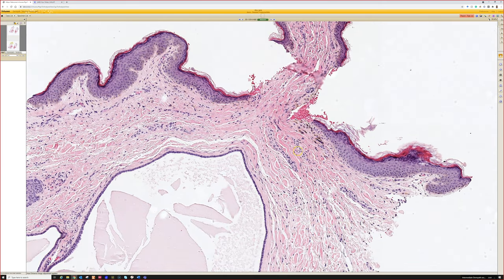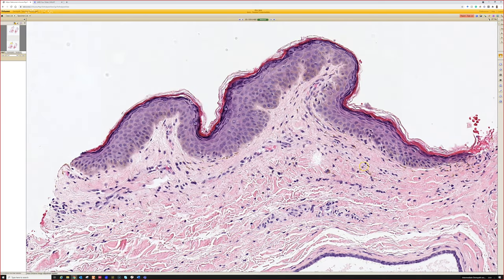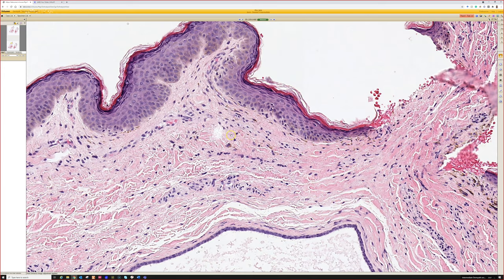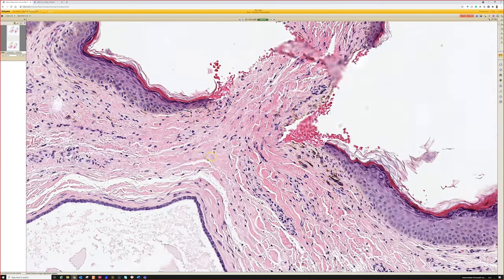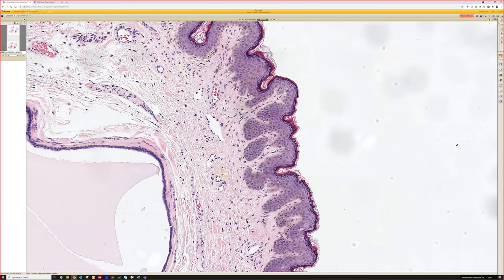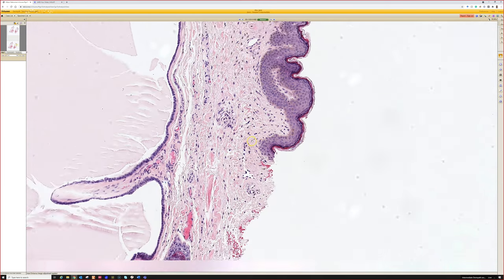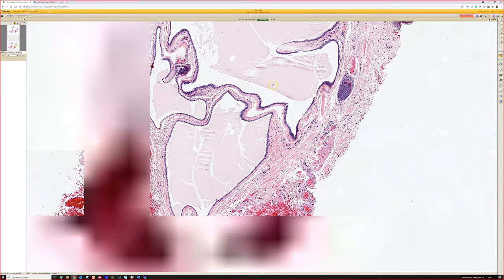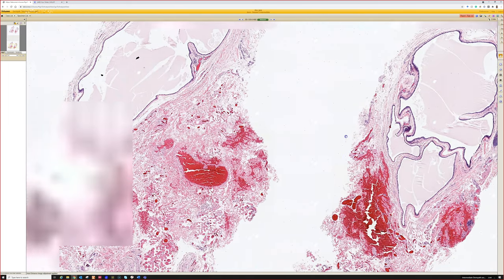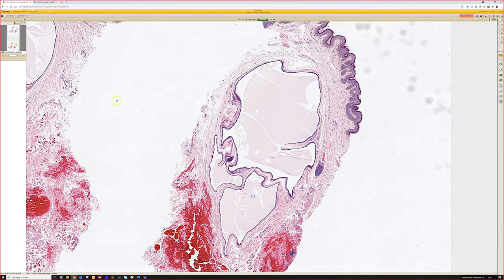And you will usually see, I can't remember if this one had it, the stromal cells in the dermis tend to have rounded nuclei and be multinucleated, like two or three little nuclei clustered together. I don't know why that is, but it's so distinct that usually you can see a biopsy and think, ooh, this is probably from the eyelid just based on that. I guess it was another case in this set that had some of those multinucleated cells. But in any case, there's a hidrocystoma. Oh, and here's a lot of skeletal muscle down here, as we would expect near the eyelid.